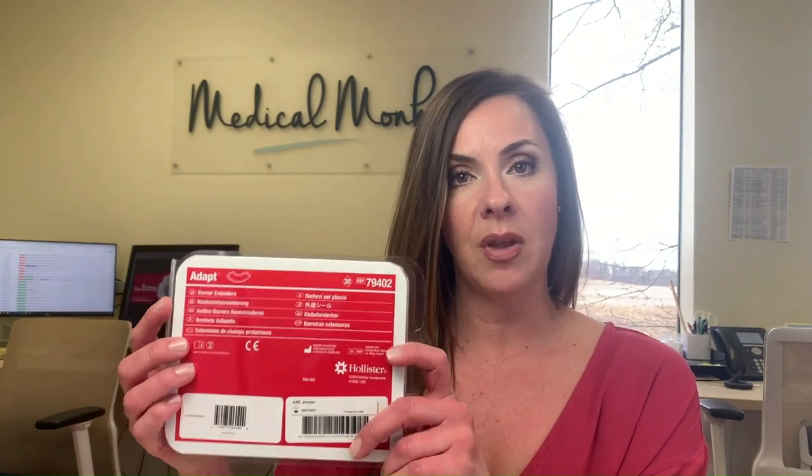Hi, thanks for joining us at Medical Monks, where your care is our highest calling. Today and this month, we're featuring a product from our partners at Hollister called the Adapt Barrier Extenders, and they come in this box, a pack of 30.